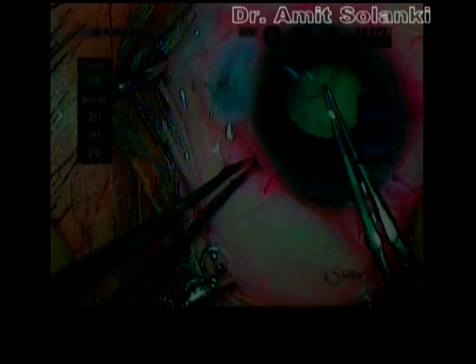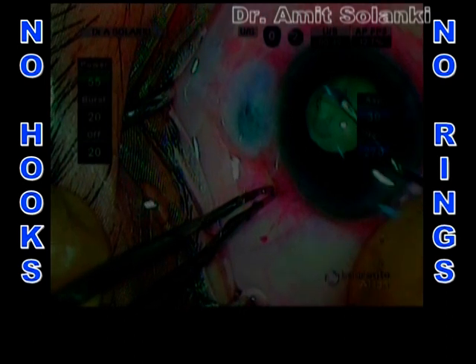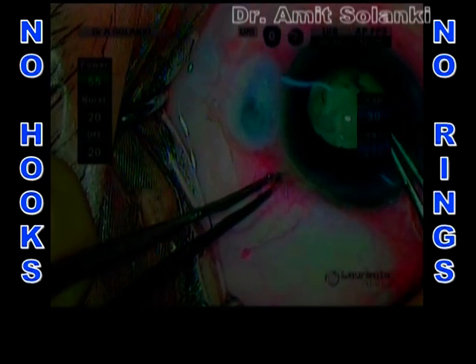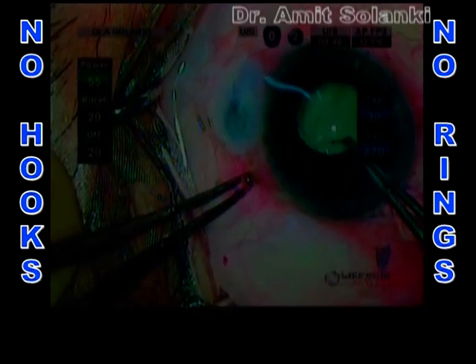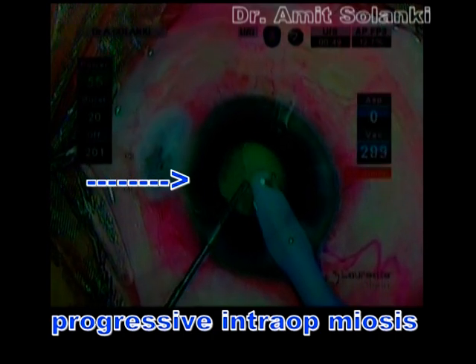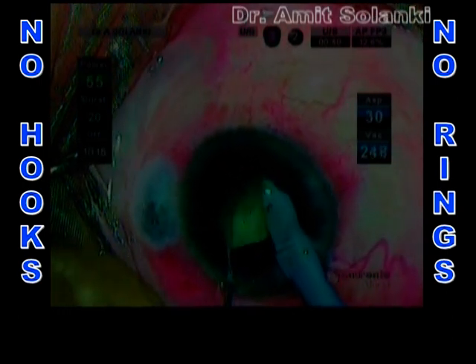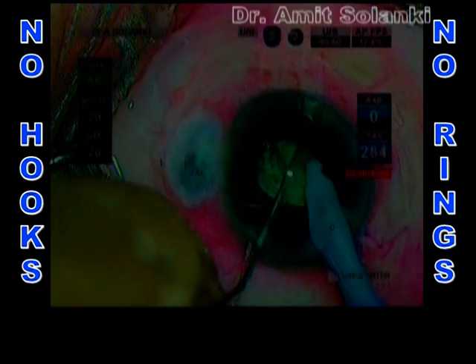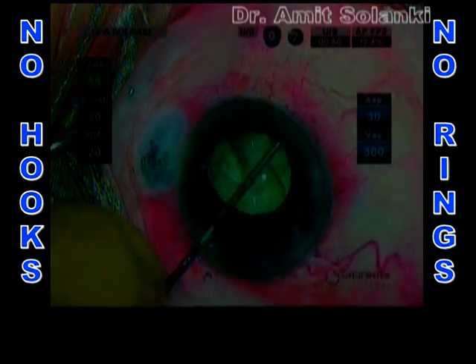Unfortunately, the rhexis got extended from one side, so I tried to complete the rhexis from the other side using a cystotome and Utrata forceps. Here, as soon as I entered with the phaco tip, the pupil was becoming smaller and smaller — progressive intraoperative miosis. In such a situation, once the tip was buried, I tried to perform maximum chops without breaking occlusion, which may prevent inadvertently catching the miotic pupil, and also reduces repeated attempts-induced trauma to the zonule and extended rhexis margin. Repeated viscomydriasis was performed.